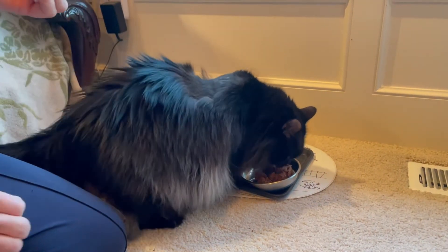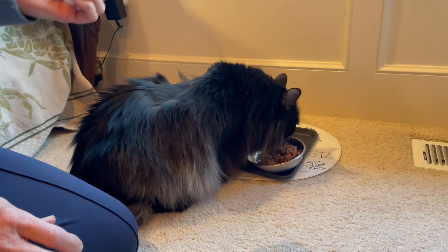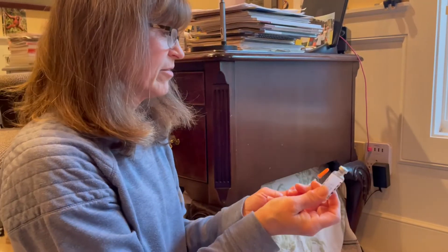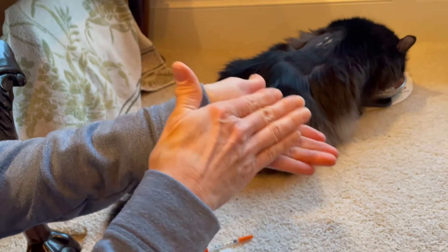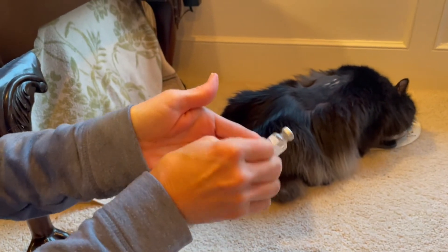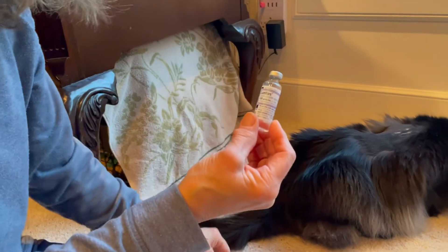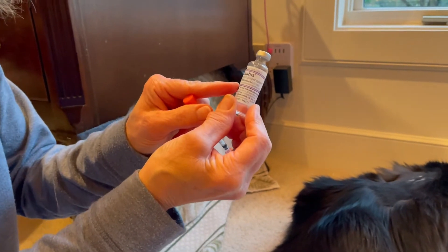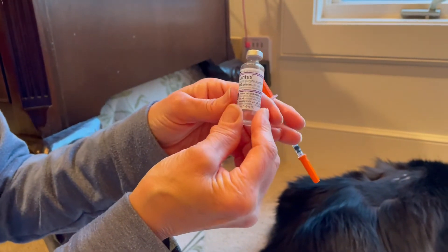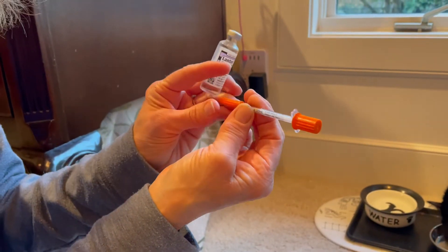Once I see that she's eaten most of her food, I'm going to come back and give her her insulin, which is even easier. Now we're going to give Tabitha her insulin — she gets one and a half units. I start by gently rolling the insulin in my hands to mix it, but you do it gently so that there aren't any air bubbles that form in the liquid. This is called U-100 because there are 100 units per milliliter, and the syringe is also U-100.